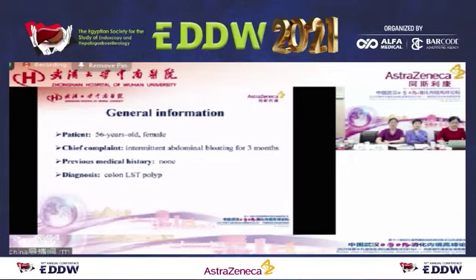Thank you. And we can see very clearly with high resolution of the capsule. So we'll move on to the next case.